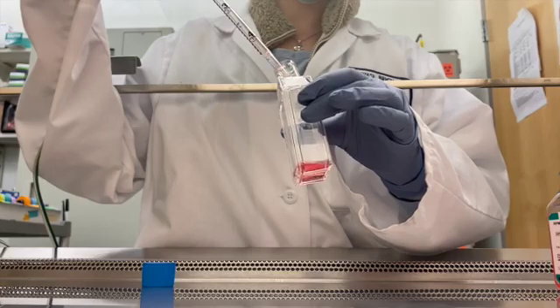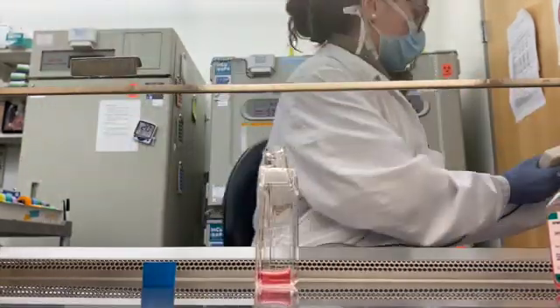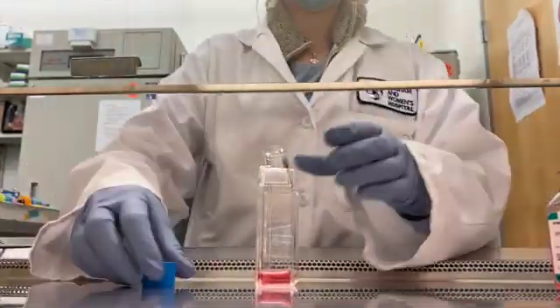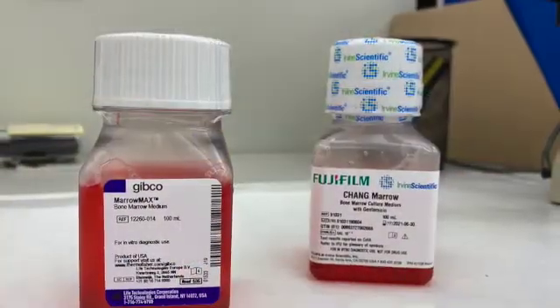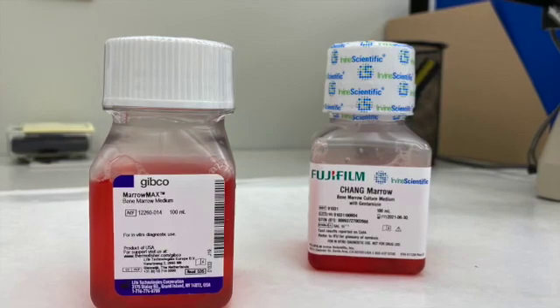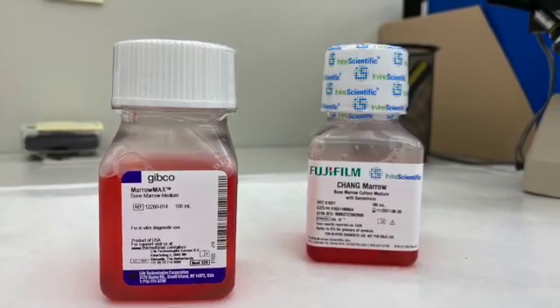Typically, we set up 2 cultures for each sample and use 2 different brands of complete media. It's smart to use 2 different types because samples can respond unpredictably, and so one may stimulate a certain sample better than the other. In addition, using different bottles of media reduces the risk of culture contamination.